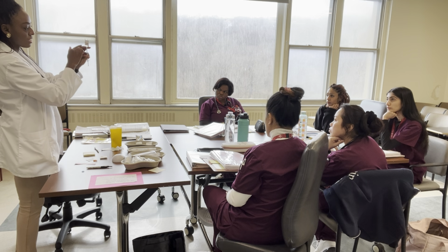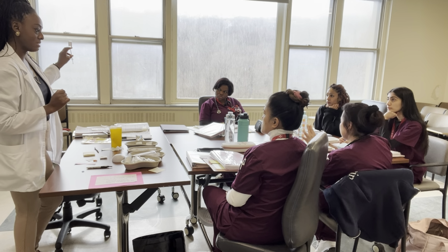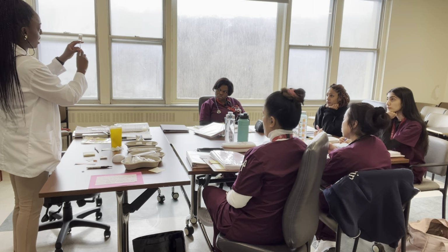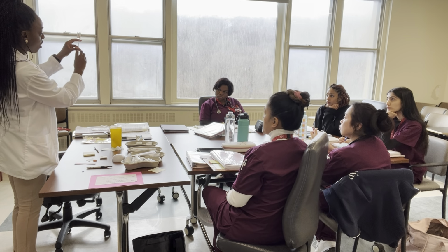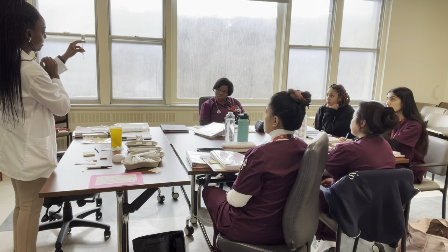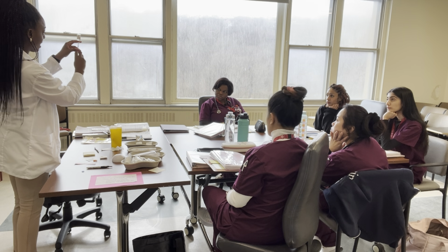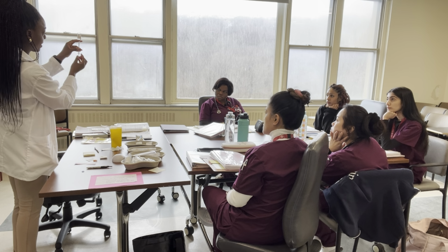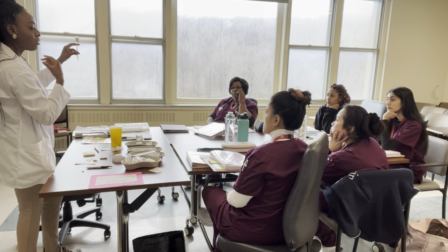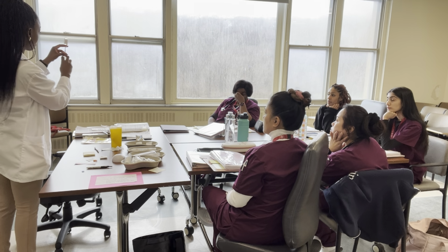And I keep my fingers in the shape of a C because it's more comfortable. See the positioning of my hands? You will all do the same afterwards. If there are air bubbles, you just push all of the fluid back up and you come back down. Make sure you get rid of all of the air bubbles. If I still have some, push it all back up. Usually the next time around, you should have no bubbles, not even microscopic bubbles. You'll see them when you're doing it.